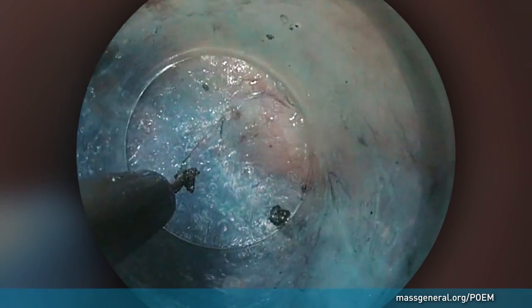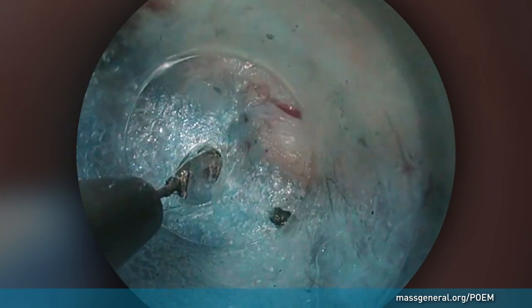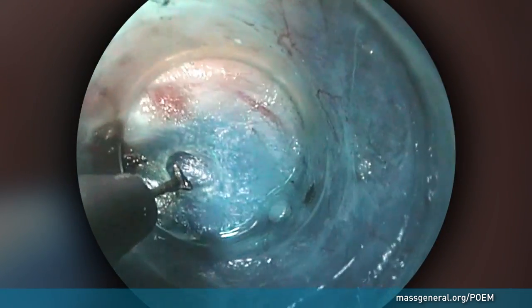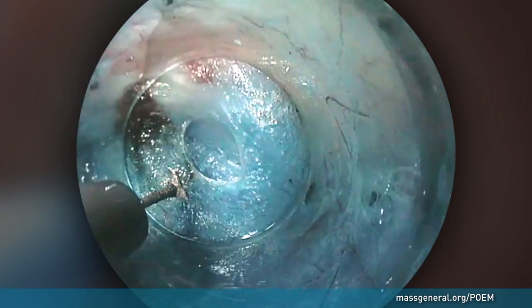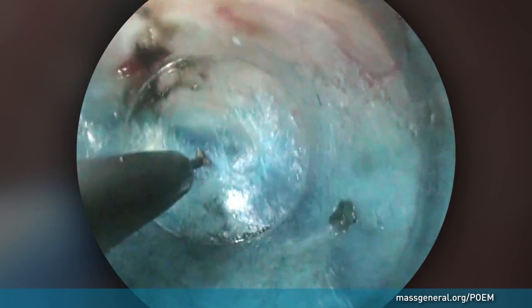As the endoscope is inserted through the opening, loose, filmy tissue is divided with brief bursts of energy, called cauterization. The surgeon creates a tunnel that extends into the wall of the stomach, three centimeters beyond the sphincter muscle. The tunnel narrows when the endoscope reaches the level of the lower esophageal sphincter.